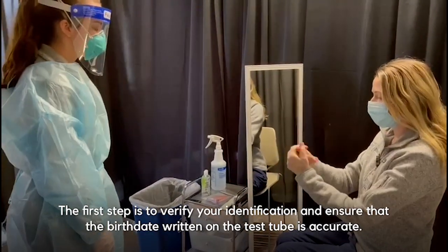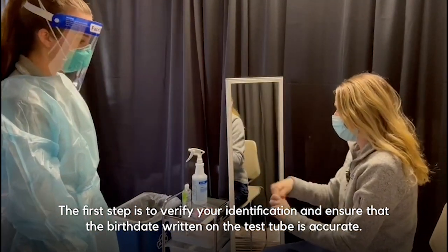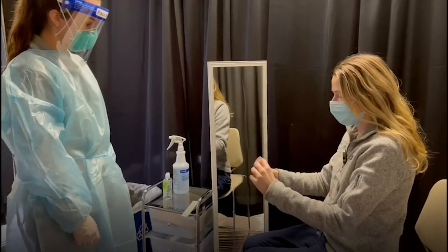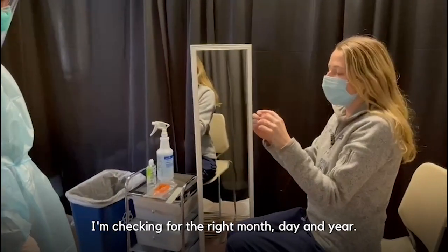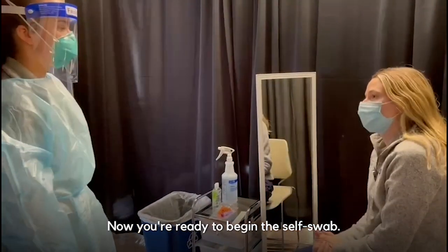The first step is to verify your identification and ensure that the birth date written on the test tube is accurate. I'll go ahead and remove my test tube to ensure that my date of birth is correct. I'm checking for the right month, date, and year. Okay, this matches. Now you're ready to begin the self swab.